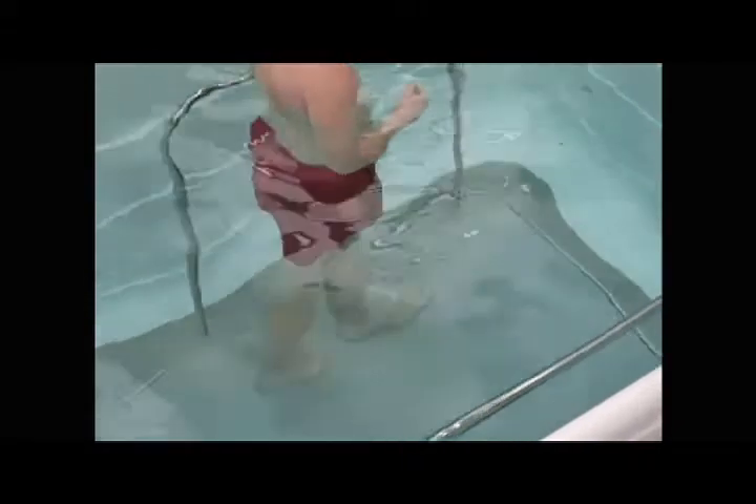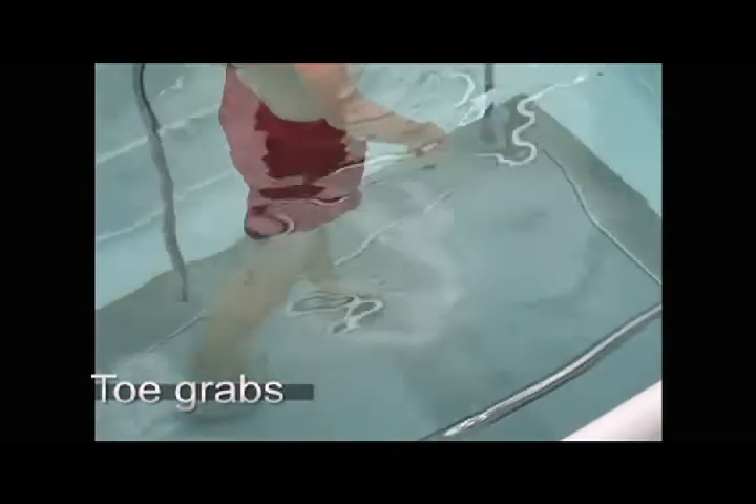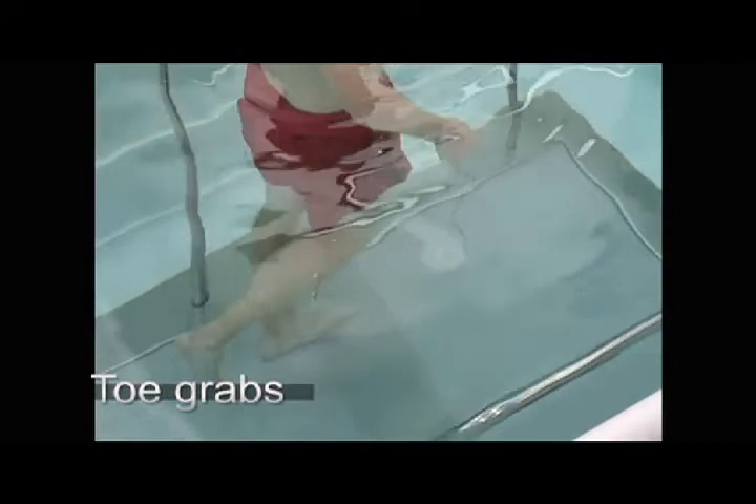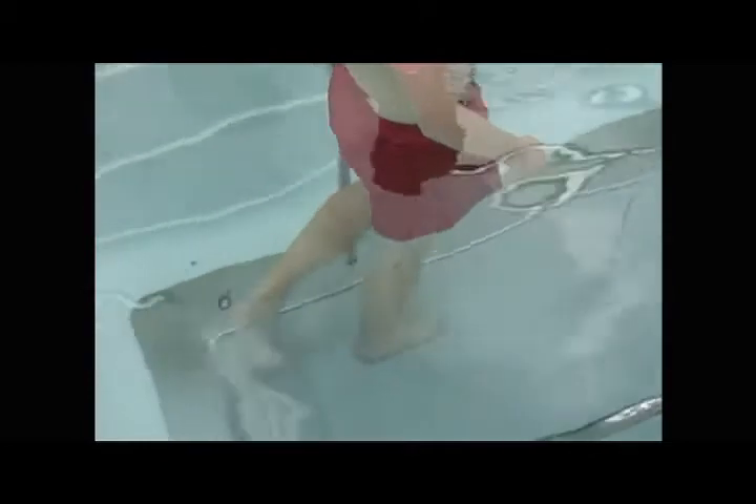The first exercise was toe grabs at 0.2 miles an hour on the treadmill. He's just trying to grab the treadmill with his toes — essentially like doing it on land with a towel, but here he's moving. That's just getting the intrinsic muscles of the foot working, about seven days after surgery.